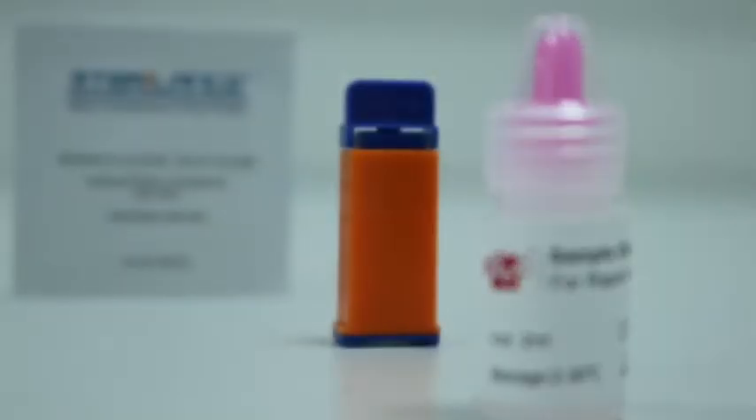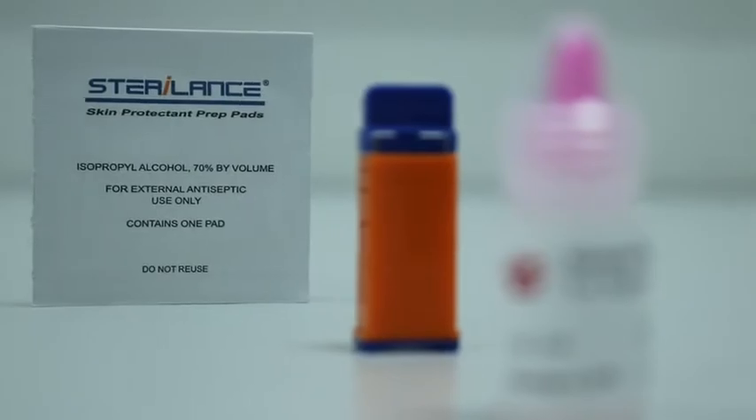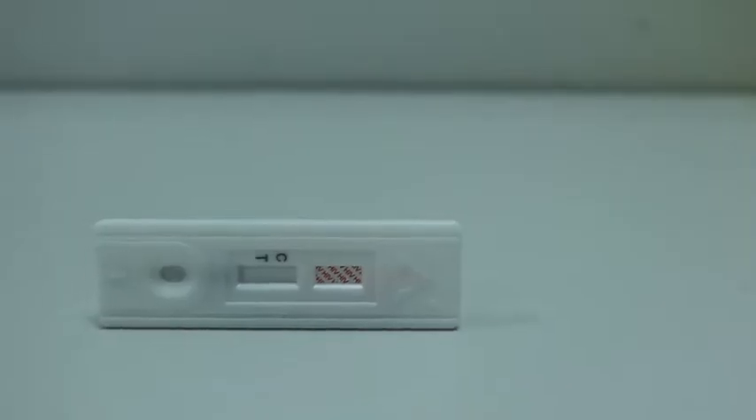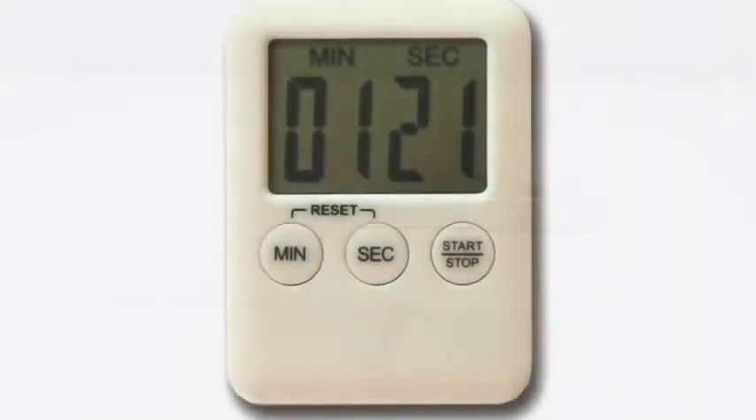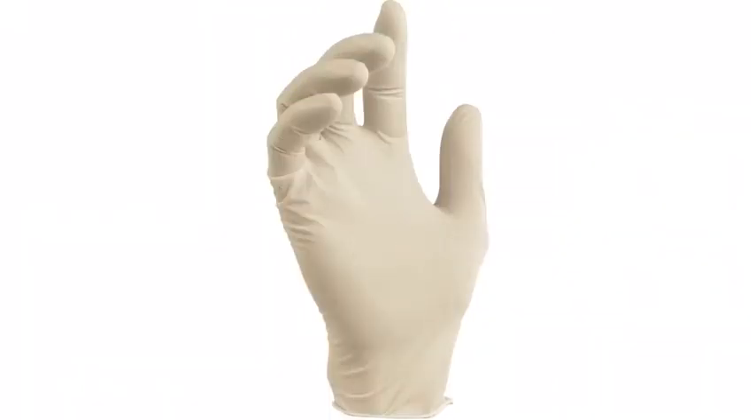Within the product packaging you will find several components included: instructions for use, a single use safety lancet, a bottle containing chase buffer, an alcohol swab, and a small pouch containing the test cassette and a dropper used for sample collection. Please note that a timer and gloves are not provided within the box but are necessary for proper operation of the test.